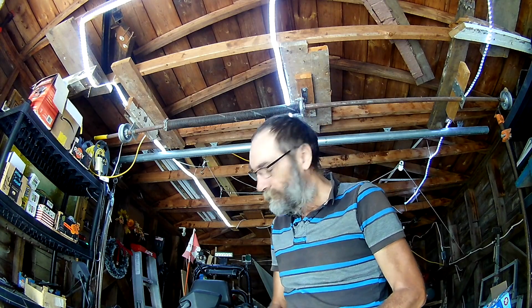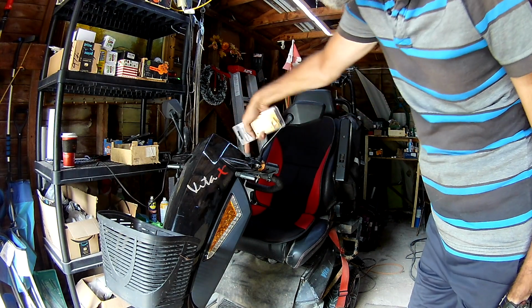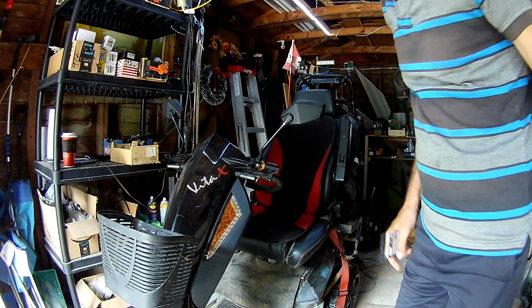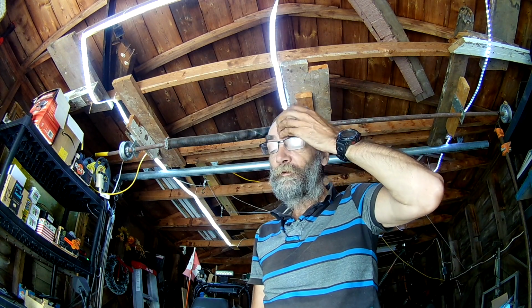A couple days ago, I noticed my mirror was off a little bit. So it turns out that I actually do need lock washers on here. Actually, on this one, this is hurt because I actually moved it, and it kind of moved out a bit. So I don't know if it came loose on its own from bumps, or if I just kind of banged into it or something, walked by, I'm not sure. So I'm going to put lock washers on, so I went and got some lock washers today.